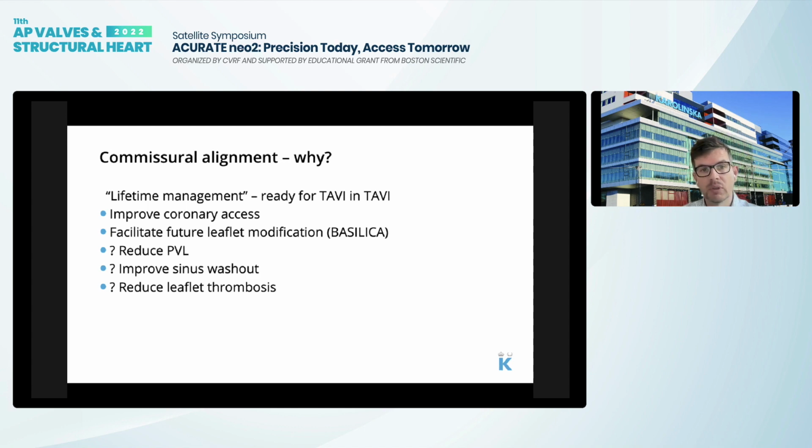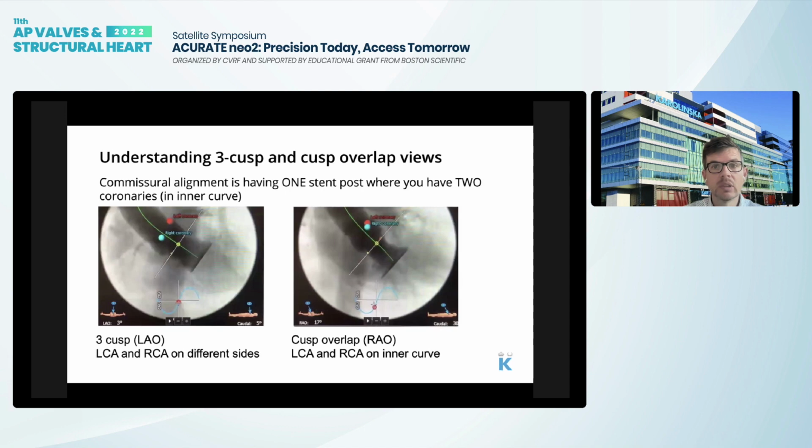There are some potential benefits that have not really been shown but could be true, like reducing PVL, improving sinus washout, reducing leaflet thrombosis, but that's more speculative at the moment.